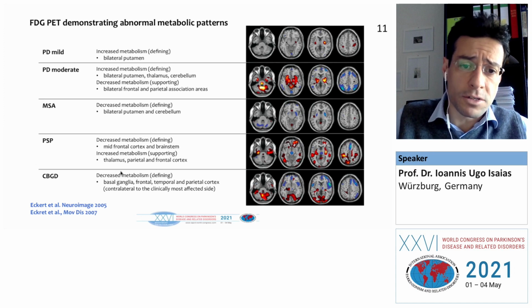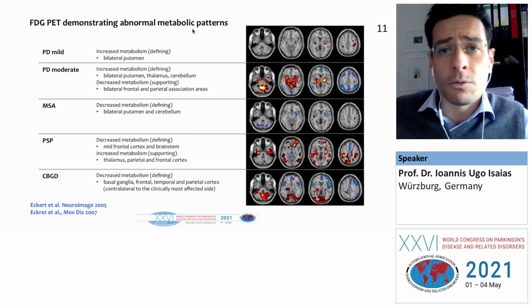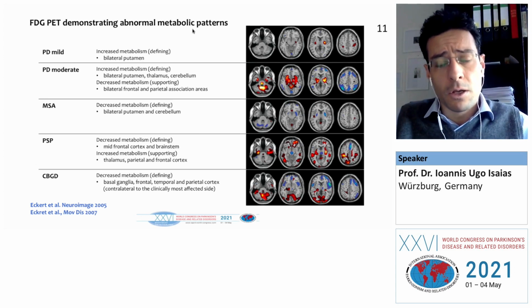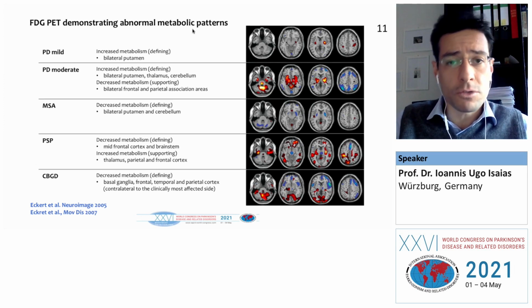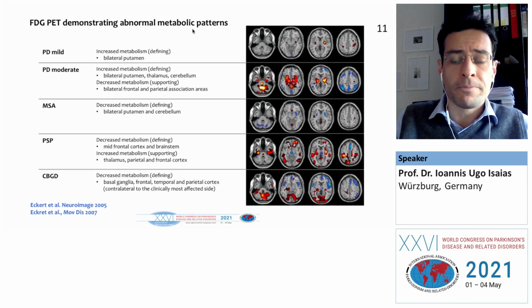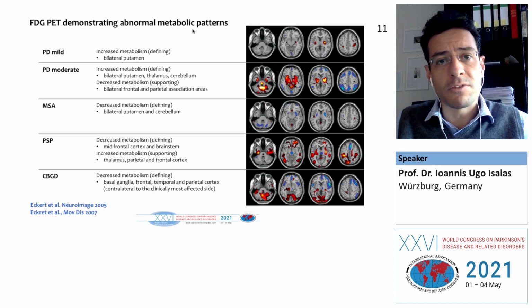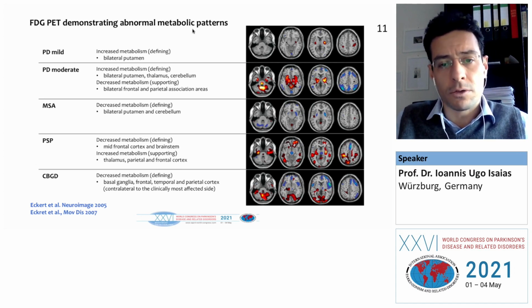These were studies performed by David Eidelberg's group over the past decades, really providing more and more evidence of the great value of glucose PET in the differential diagnosis, also at a very early stage, and also in a single subject case, in the context of Parkinson's disease and parkinsonism. They were also able to identify specific patterns whose expression is evocative of Parkinson's disease or other parkinsonism.